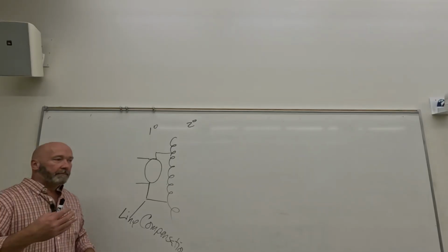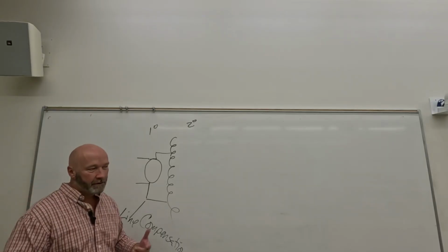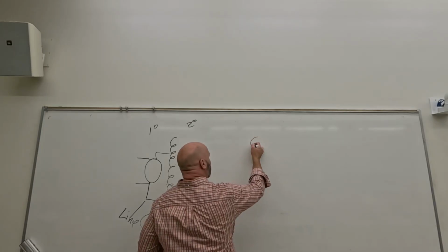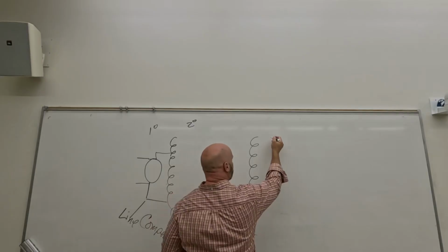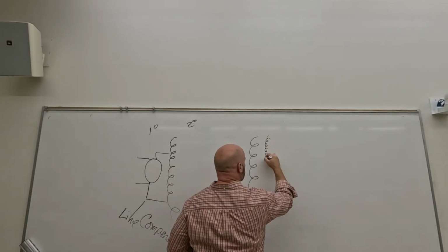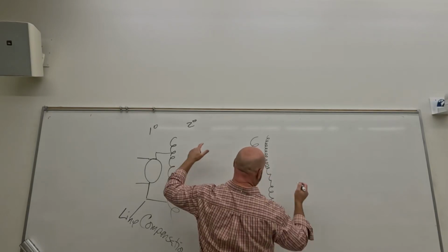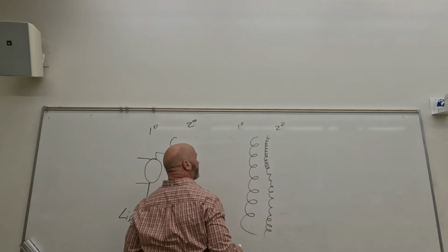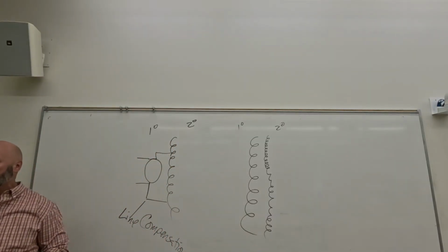The x-ray tube comes in a different section. We already talked really about the high voltage transformer. The high voltage transformer is not a variable turns ratio. It always has more turns on the secondary side than it has on the primary side. So our voltage always goes up by a predictable amount.